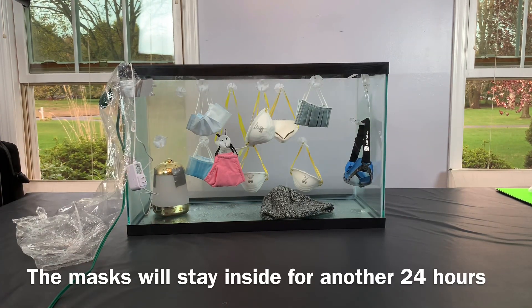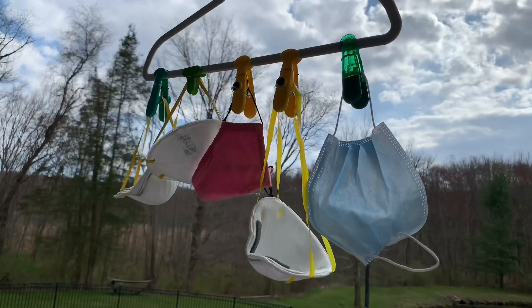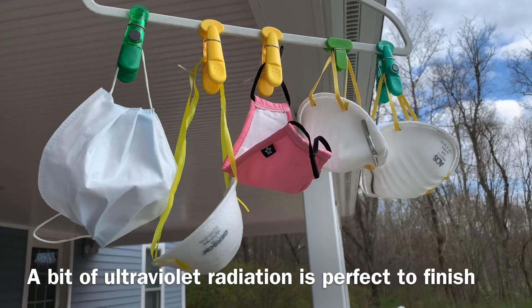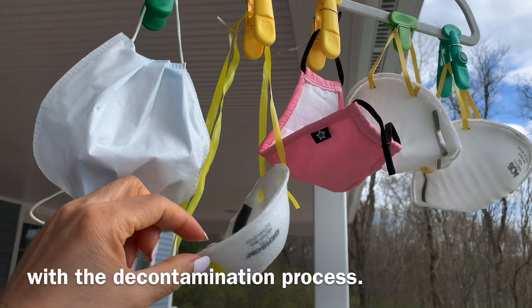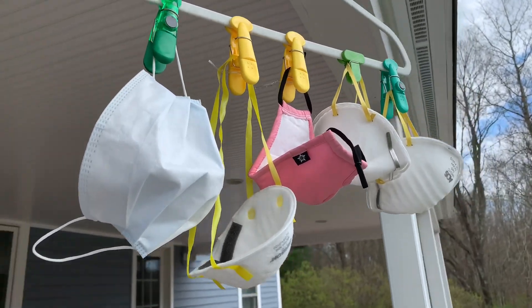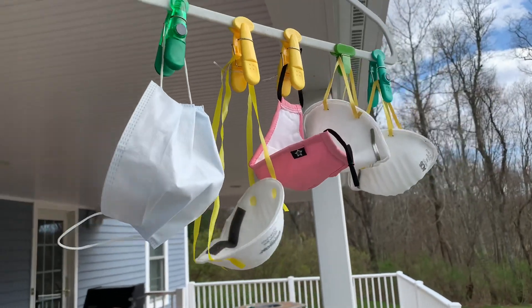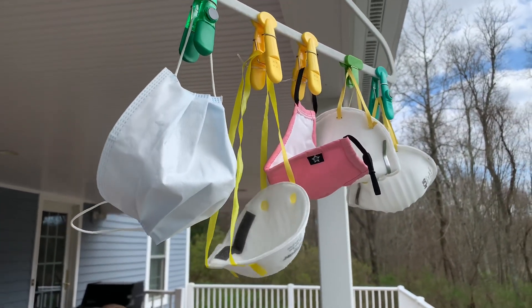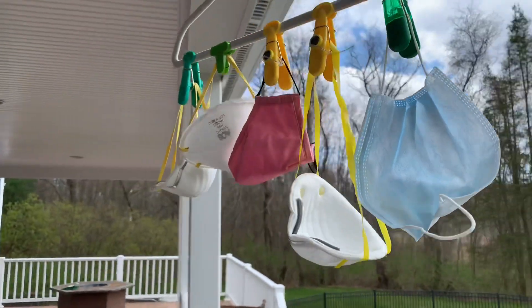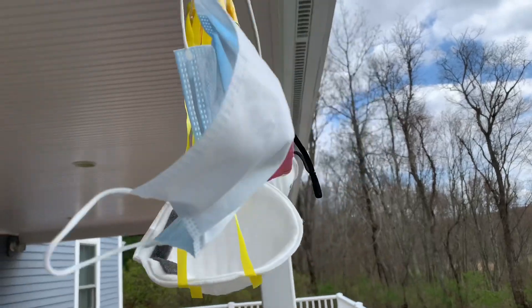I'm going to let the masks air for a day right inside the fish tank — the same goes for the goggles and the hat. After that, I take the masks outside to air and get rid of the little bit of hydrogen peroxide smell. I'd leave them for 12 hours or a full day. Make sure it's not going to rain, and don't leave them out at nighttime — just while it's sunny. Then bring them in at night and take them back out the next day for another 12 hours.